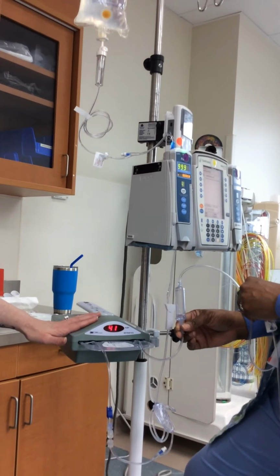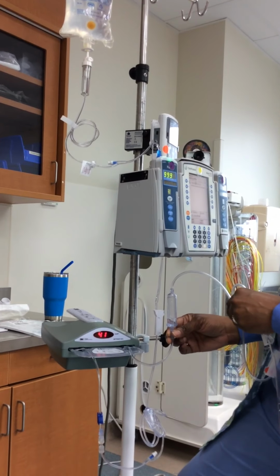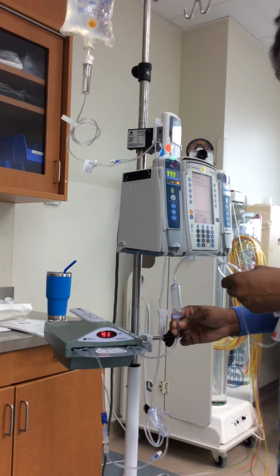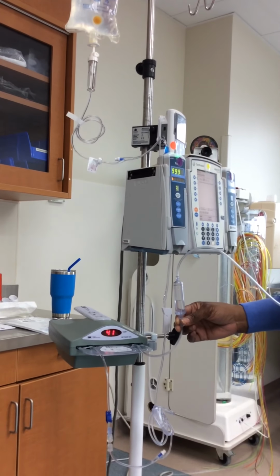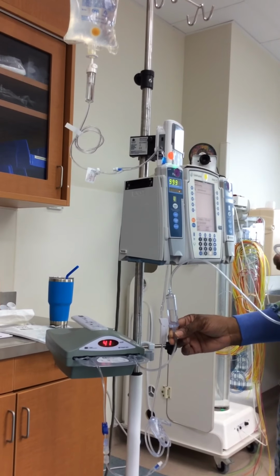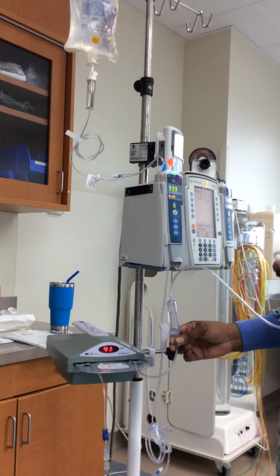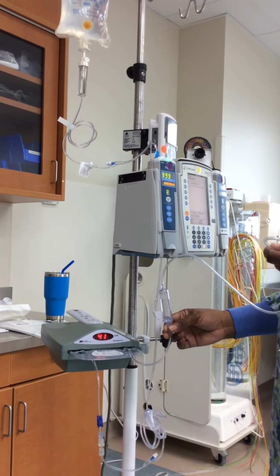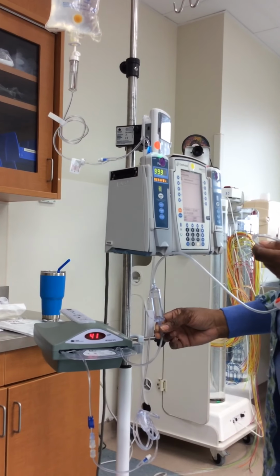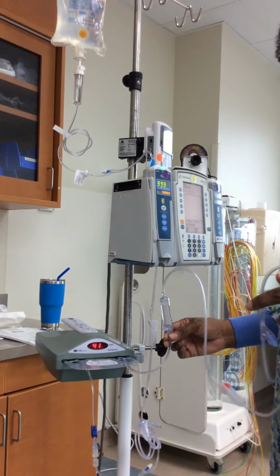As you can see, the fluid is starting to fill up. Keisha has inverted the chamber so that she can go ahead and fill that up all the way. Almost there. Like watching water boil on the stove.